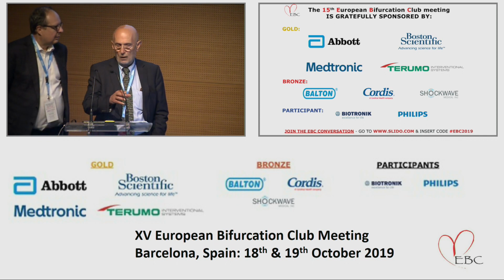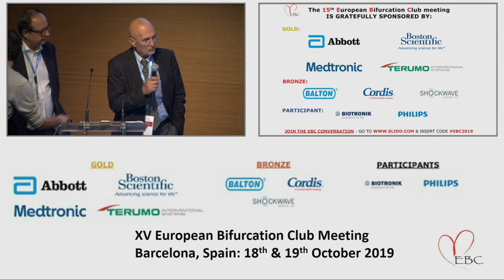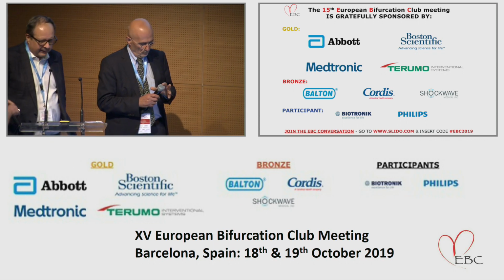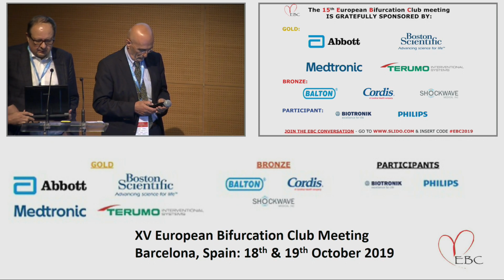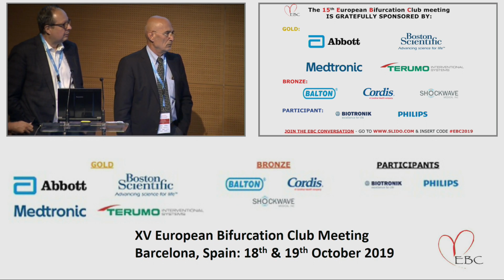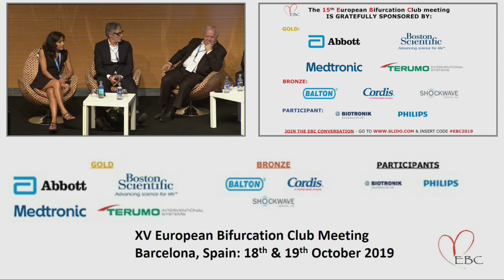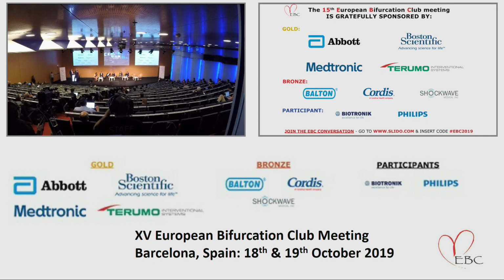I have a question. So the main goal of the DK crush is first to not miss the ostium, and second to have a nice opening of the side branch ostium and to avoid a bunch of struts in front of the side branch. But the only caveat is that it's a little bit time consuming, with a lot of steps to do.